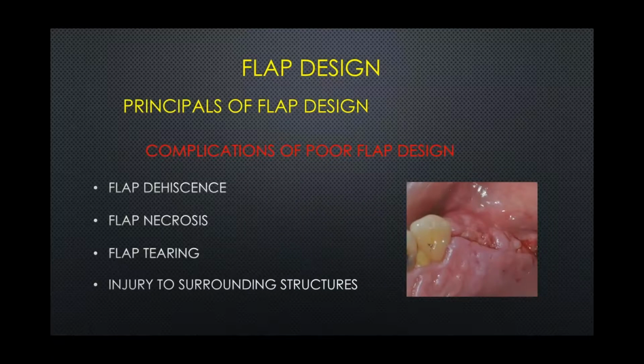Okay, when we talk about flap design, we would be remiss if we didn't talk about complications of a poor flap design.